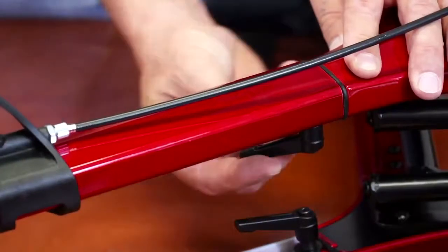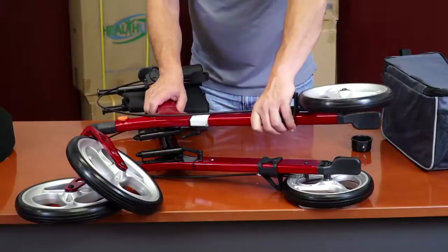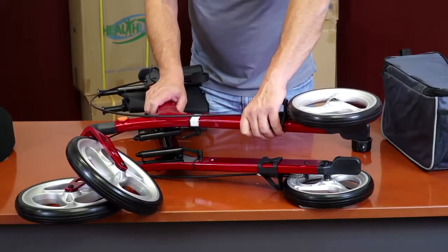Screw the knob all the way, but do not over-tighten. Repeat the same procedure for the other leg.